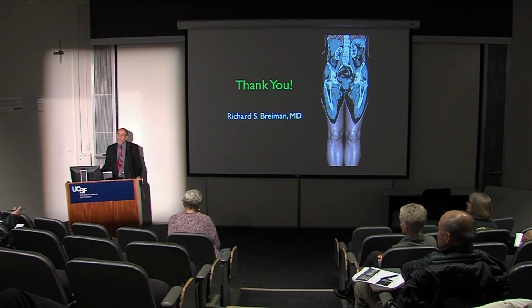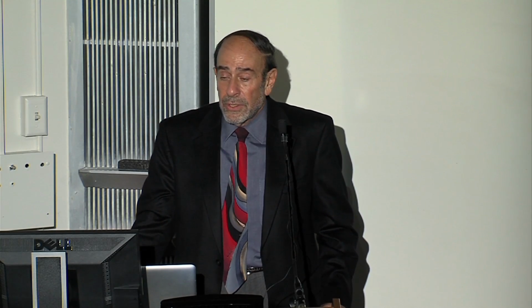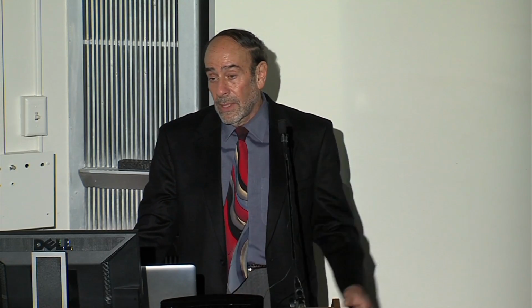So for those companies, there are people that come around. They have applications people. That means applications are training people. They are trained by their company to go out and train other people, users. So everything we do, a new CT scanner, they bring trainers. I just trained yesterday. The computer system that I showed you with the workstation, we're getting a brand new one Monday. It goes operational Monday. And I just had my training session yesterday.